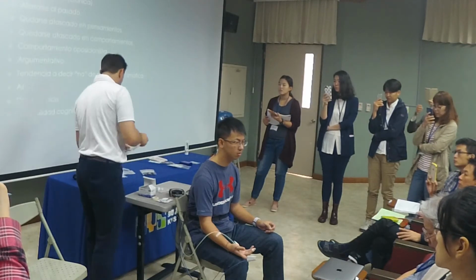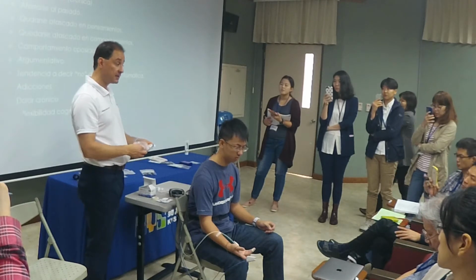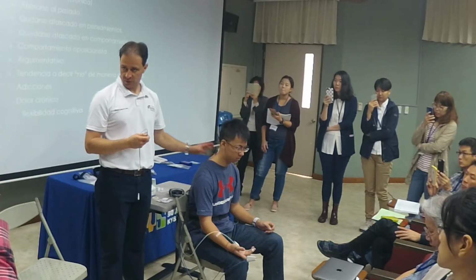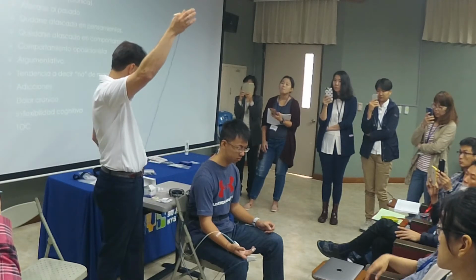Oh, this is the ground cable. We need to place a ground cable in between the active sensors, otherwise we're going to have noise. Because if we put it like this, they're going to cancel each other out. So you're going to get noise in the signal. You always need your ground sensor.